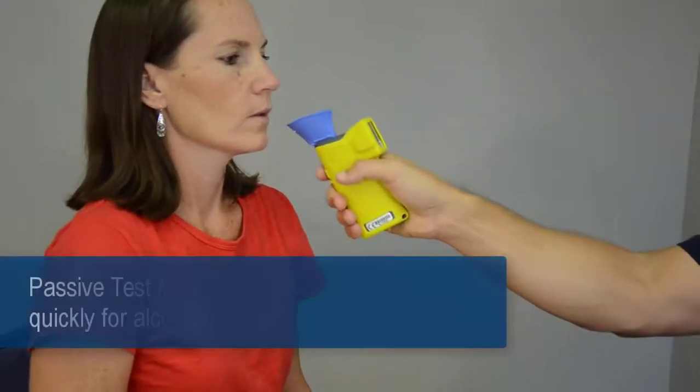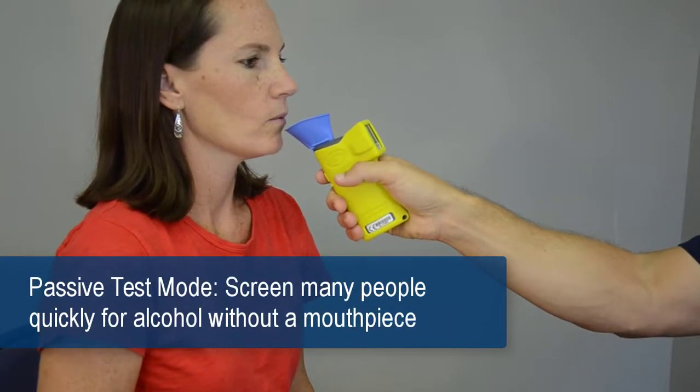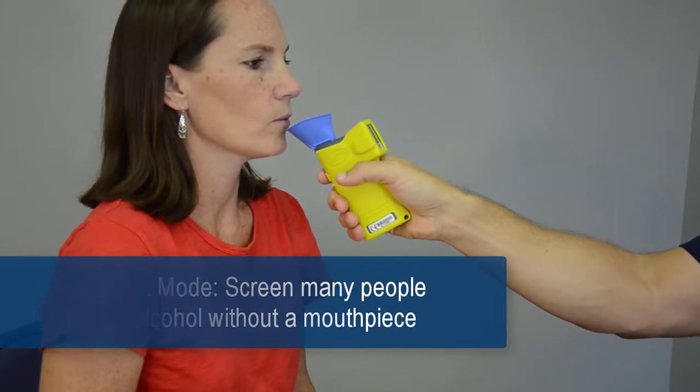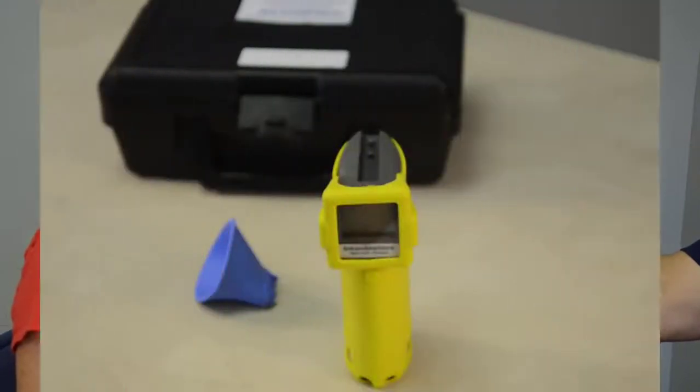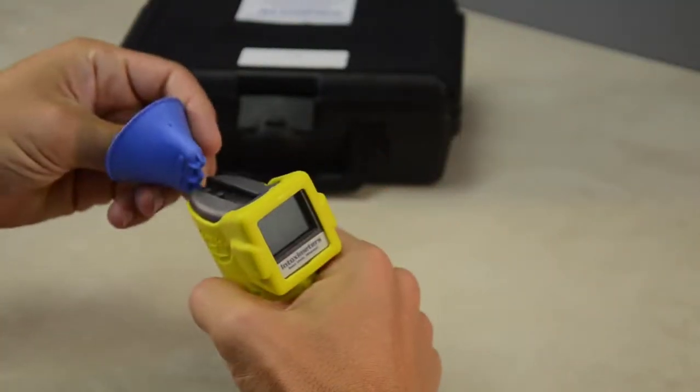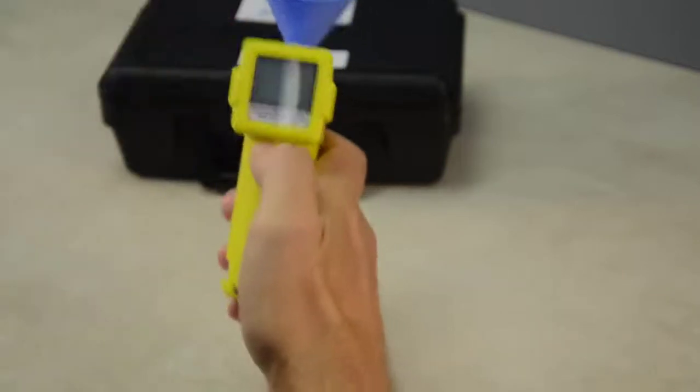The passive test mode allows the operator to screen many people very quickly for the presence of alcohol, without using a mouthpiece. Attach a breath sampling cup by aligning the holes over the inlet ports and snapping it into place.